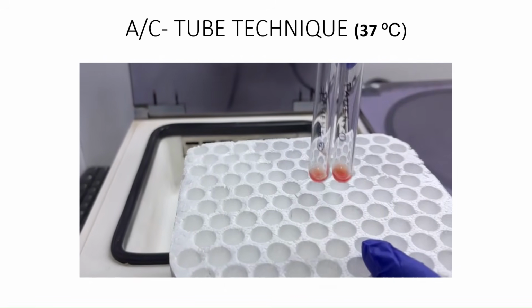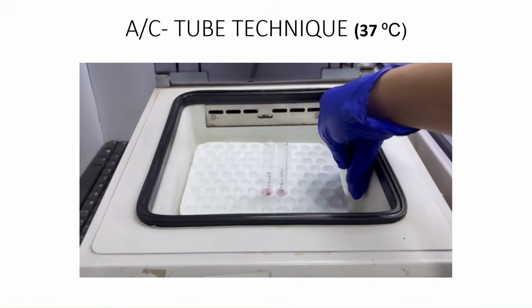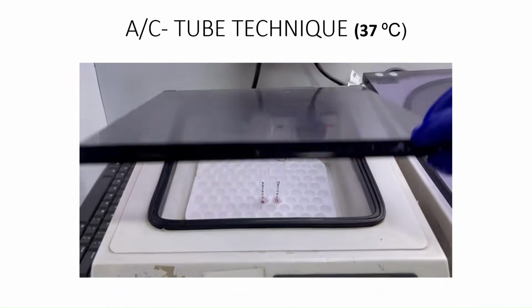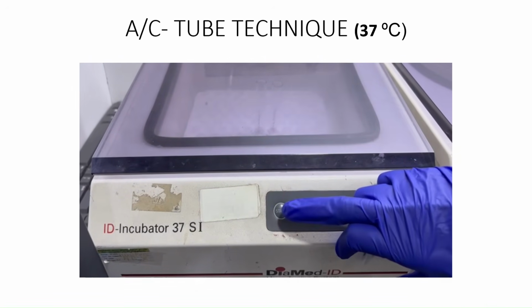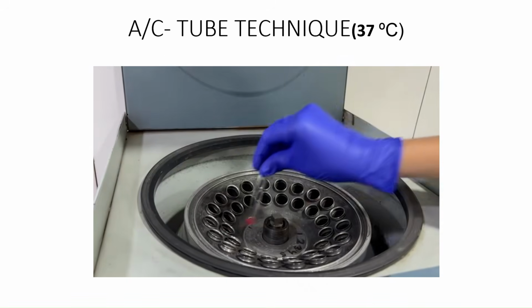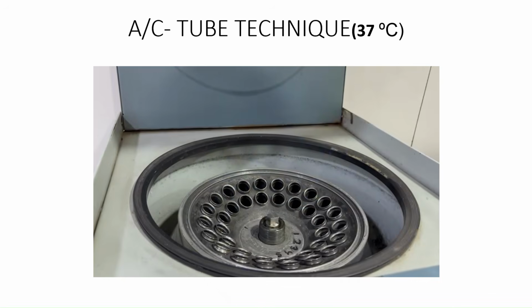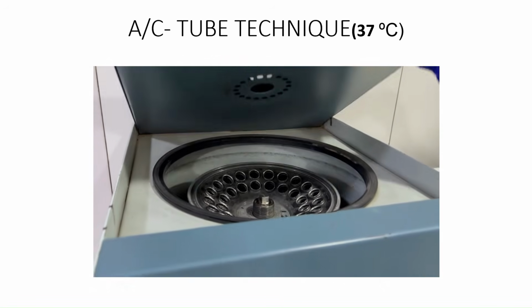Now we are going to perform autocontrol at 37 degrees Celsius. This will help us to know whether there are clinically significant antibodies in the patient. So for this, both the test tubes are kept in an incubator set at 37 degrees Celsius for 15 to 30 minutes. Next, centrifuge the tube by proper balancing and look for agglutination reaction.